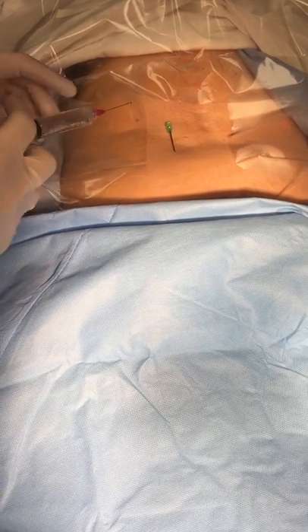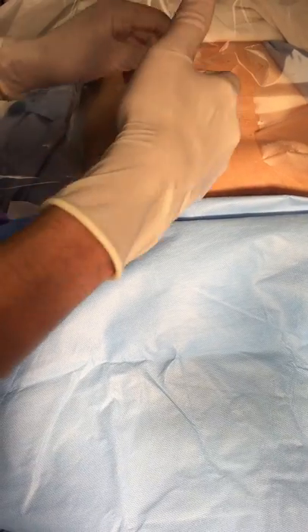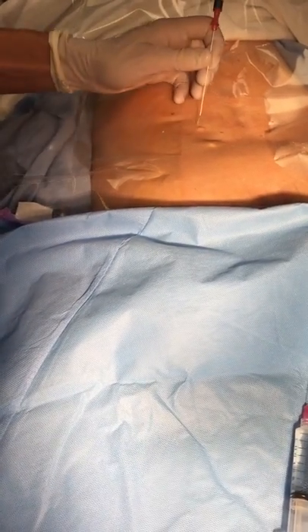This is sacroiliac joint radiofrequency ablation, a procedure which I've been performing throughout my years of practice. If a patient has a diagnostic sacroiliac joint, then this is the most definitive and permanent treatment.